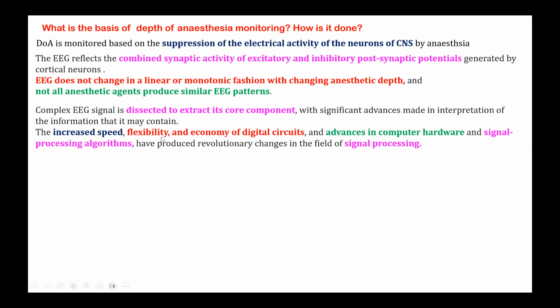So the increased speed, flexibility, and economy of digital circuits, as well as advances in computer hardware and signal processing algorithms, have made changes in the signal processing. This is the very important technical improvement that has made depth of anesthesia monitoring possible.